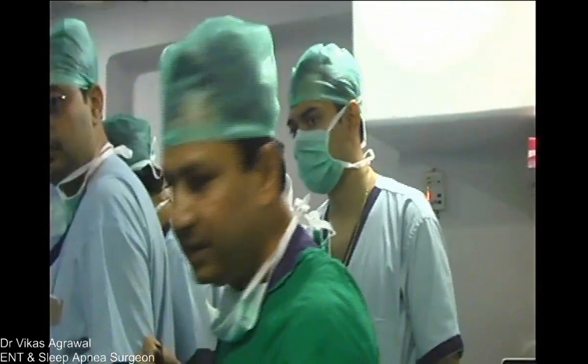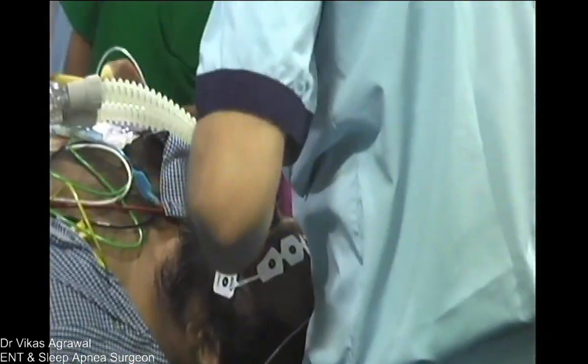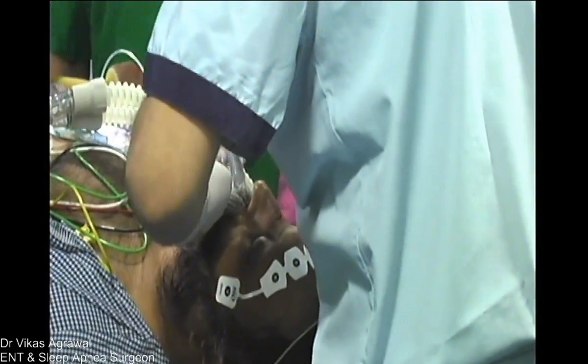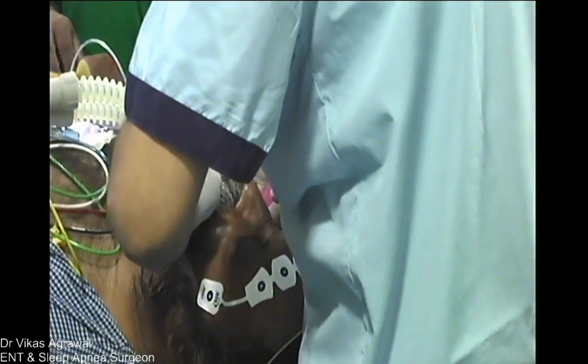Kalpesh is now showing the insertion of the LMA. So he is inserting the LMA, as you can see there.